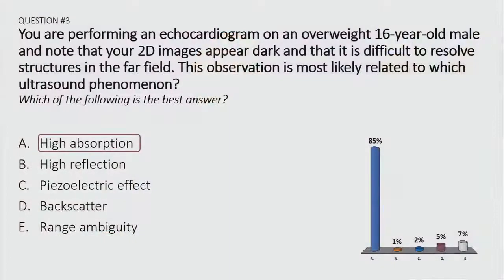High reflection would give you the opposite effect. Things would be bright. Piezoelectric effect, it's cool, but it doesn't apply to this situation. Backscatter doesn't apply, and range ambiguity applies to Doppler principles and not to this 2D imaging scenario.